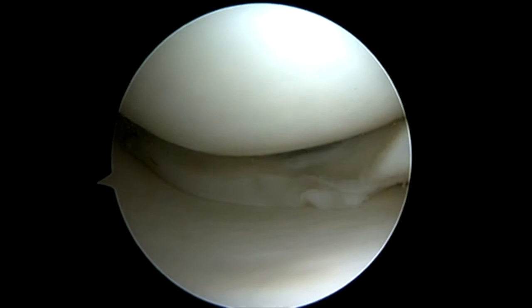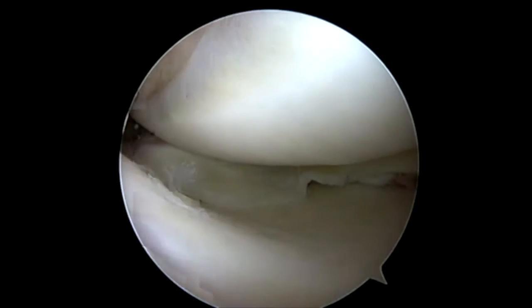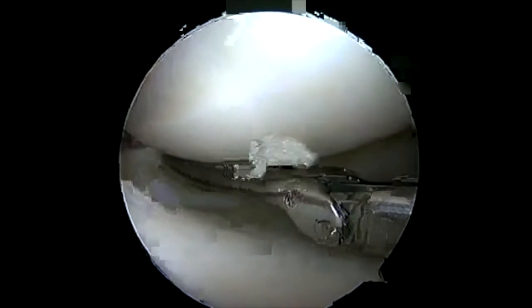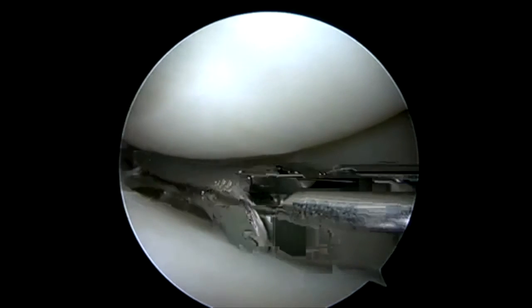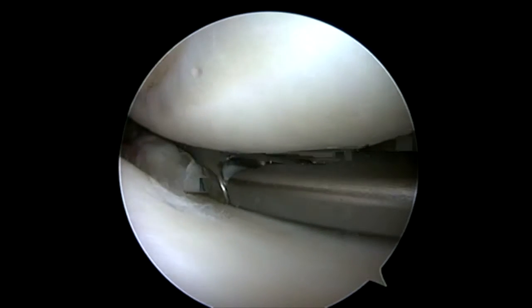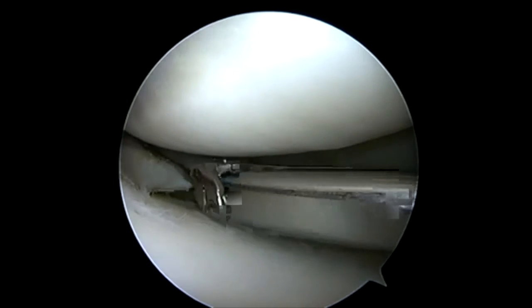Now that I feel I've got an adequate joint space, we'll proceed with repair. I will repair from one end — either posterior or anterior — and leave the central aspect until later. What I've found is if I try to repair the central aspect first, the meniscus simply flips back into the joint and doesn't stay reduced. By getting my posterior horn or anterior horn down first, I can just work around the meniscus.